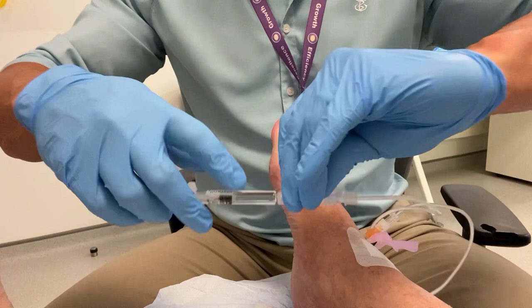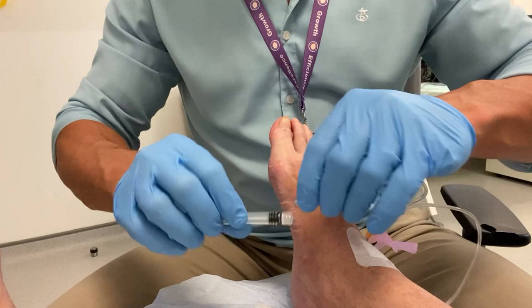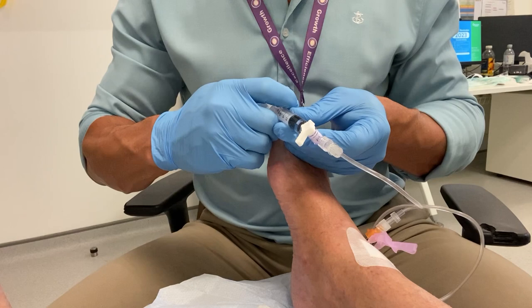This injection is going into the subtalar joint via the sinus tarsae, and this is certainly the easiest way of performing subtalar joint injections. We flush the line with some local anesthetic — most of this doesn't go into the patient's ankle, it just clears the line. The trick here is you can feel the pressure of the thicker hyaluronic acid going through the 25-gauge needle.